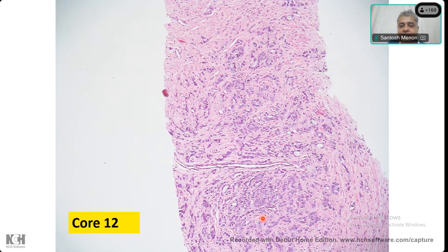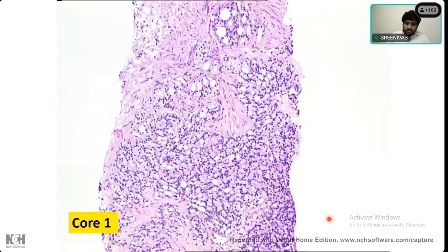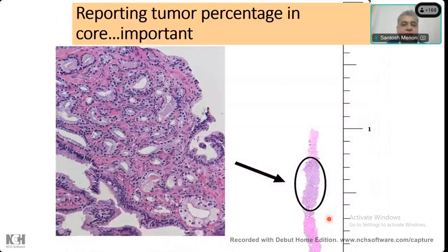So this is nothing but maybe there is some pattern 5, there is definitely pattern 4, some maybe pattern 3. So you have to look at the whole picture. Right? Fine? Again, I'll go back a little bit. So we have been talking about Gleason.